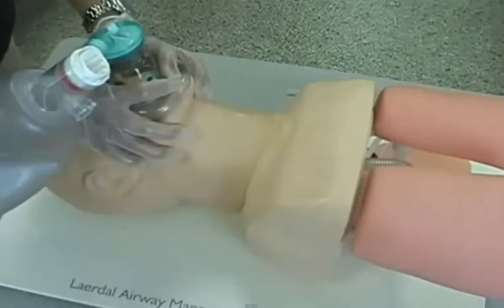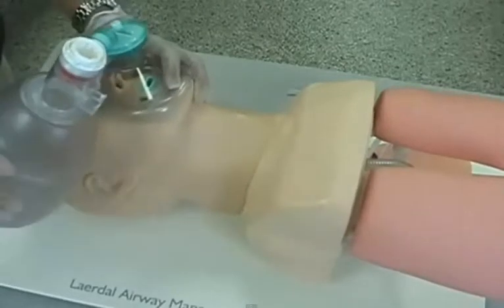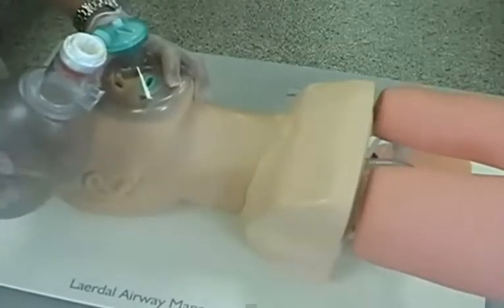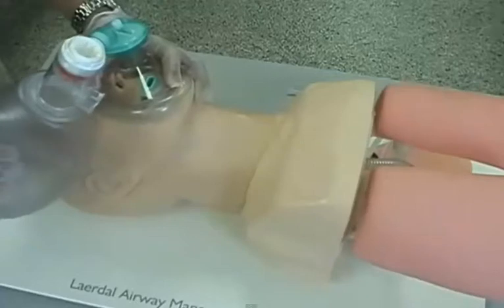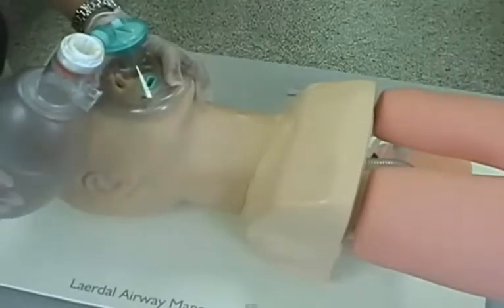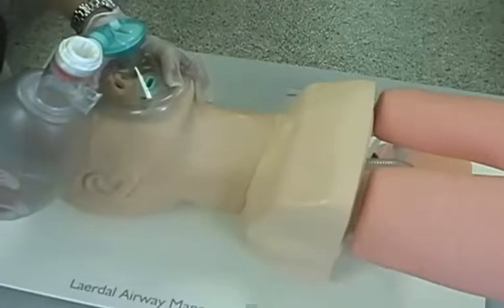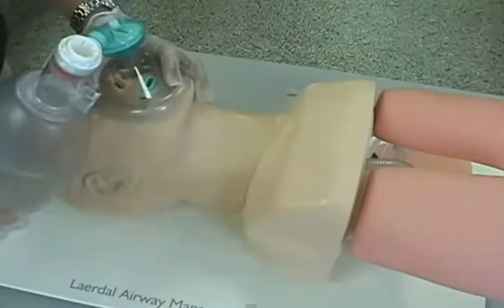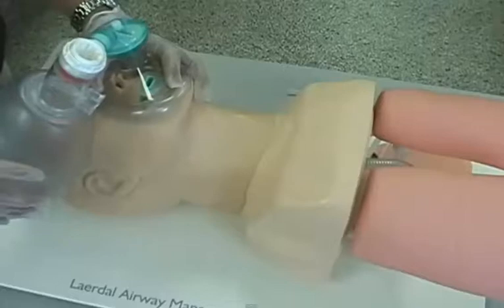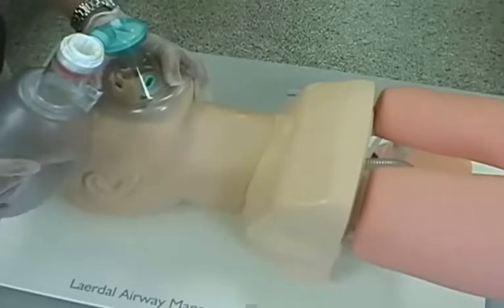Now one thing that you want to make sure that you do, we mentioned the nice slow volumes. You don't want to try and bag hard and fast like this. That's a guaranteed way to force high airway pressures, and we're going to force air into the esophagus and into the stomach, and guaranteed if we keep doing that long enough, we're going to cause the patient to vomit, and then we're going to have an aspiration problem on our hands. So gentle, slow ventilations is definitely preferred.